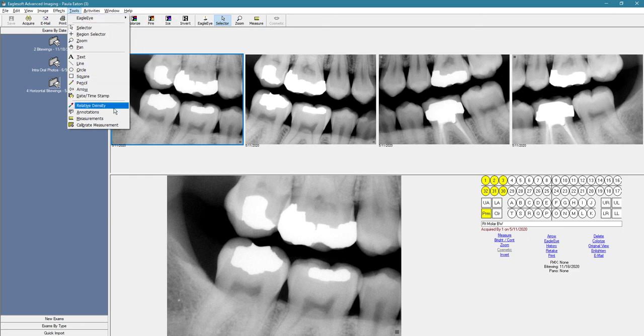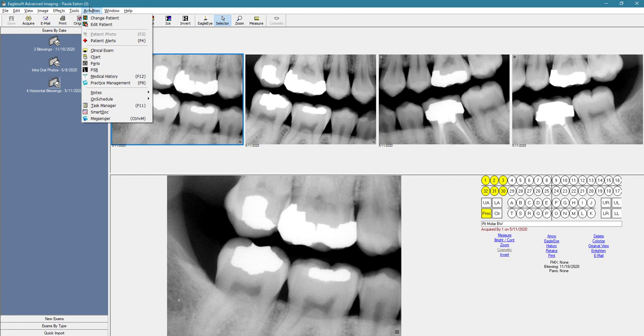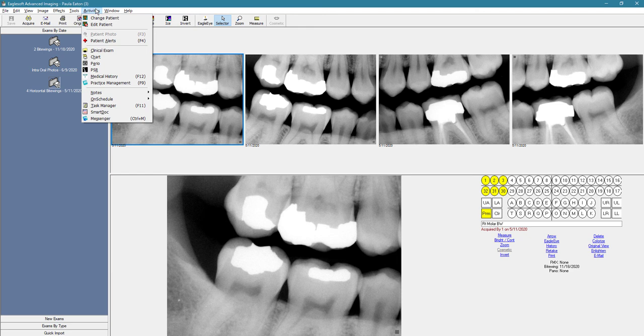Under activities, you could change your patients. You can check the patient's alert. You can jump back to the chart or perio chart. And if you don't see the tool you're looking for and you use it often, you can also customize the toolbar and add that tool to the toolbar.